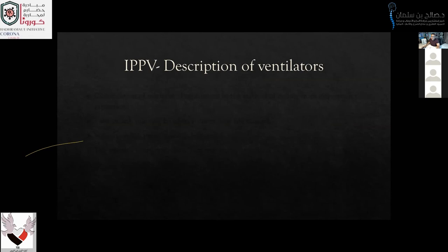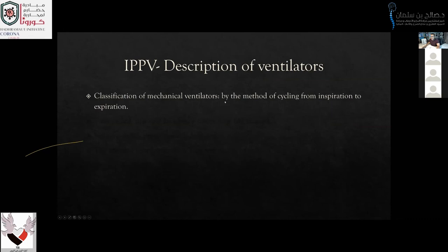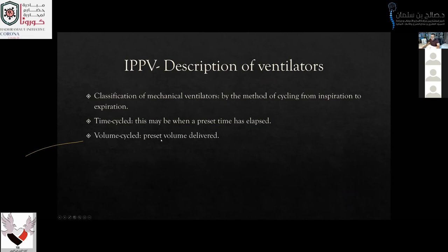Intermittent positive pressure ventilation, description of the ventilators. Classification of the mechanical ventilator by the method of cycling from inspiration to expiration: time cycled, which may be when the preset time has elapsed; volume cycled, when the preset volume of gases is delivered.